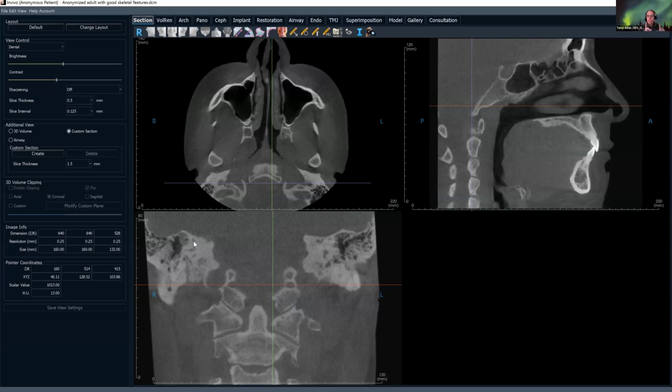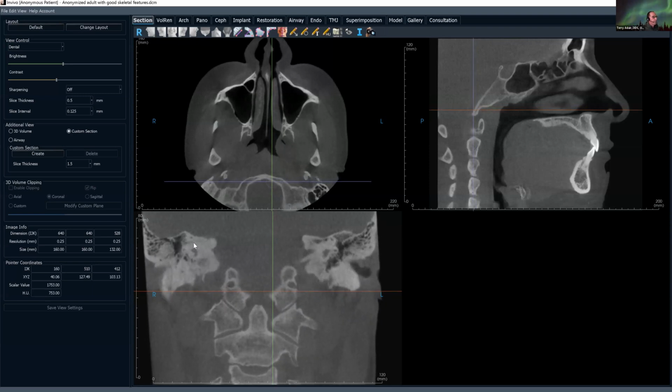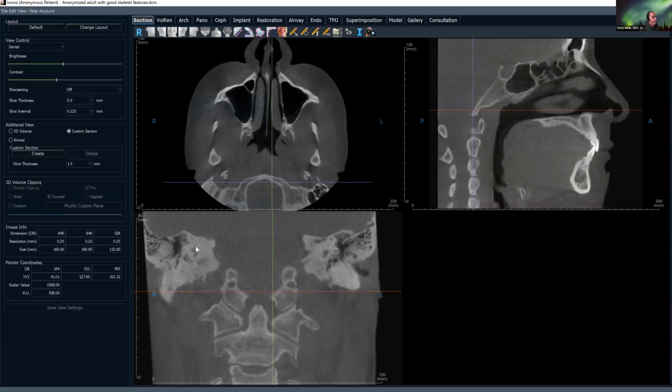So you know that the semicircular canal is the organ for balance. And it has 3 circular canals at more or less right angles, not exactly, but more or less right angles to each other. And this is the one that we're looking for primarily here. So I will scroll through here and see if this is fully encased in bone. And in this case, it is. You see this little tiny arch there? So this is a pretty fine structure to look at. And then it comes down here. And then you can see it opens up into where the other canals are. So again, this is the semicircular canal right here.